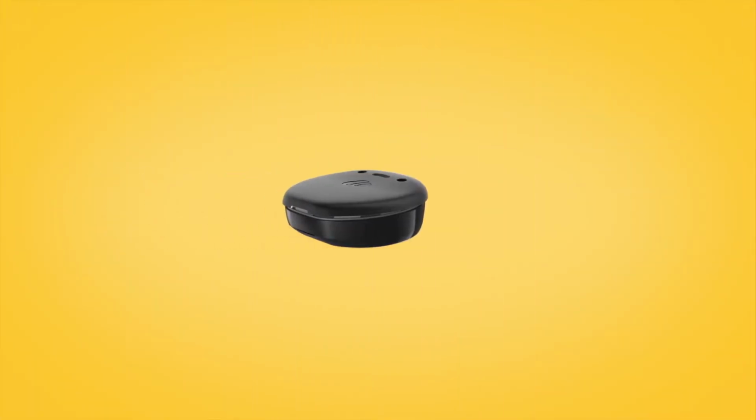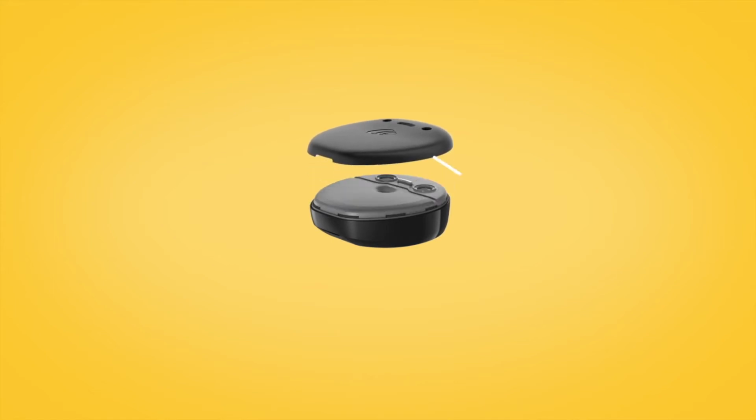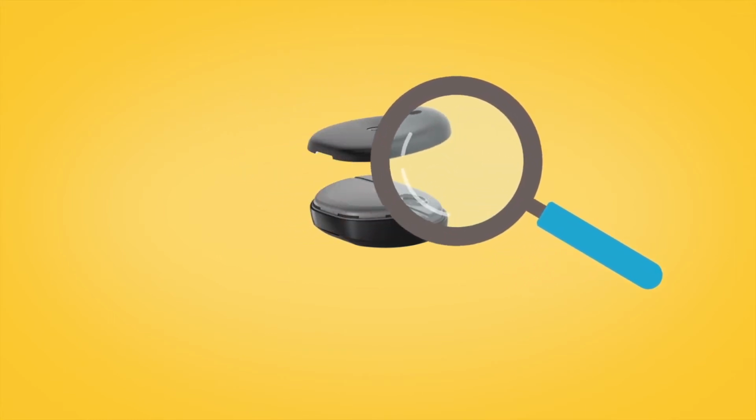The microphone protectors on your Kanso 2 sound processor are attached to the underside of your sound processor's cover. You should check them for signs of dirt or grime every day.